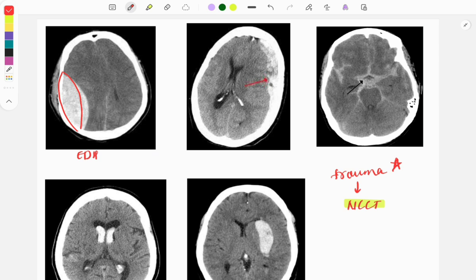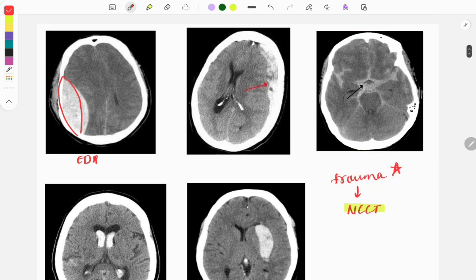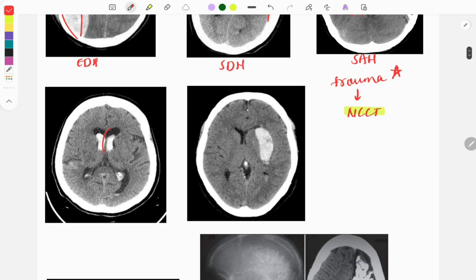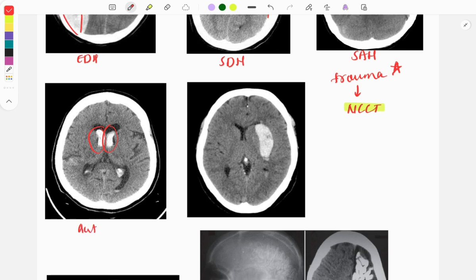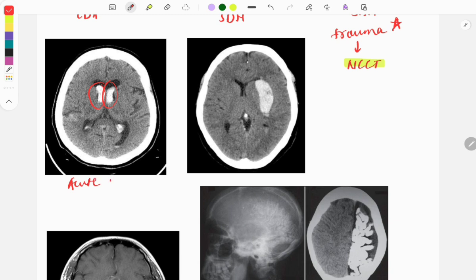There is no way you can skip brain hemorrhages — you need to know every point related to them. The next image shows subdural hemorrhage: the bleeding is crescent-shaped, a classical finding seen in subdural hemorrhage. The next image shows a star-like appearance called the star of death, seen in subarachnoid hemorrhage. Then there is an image showing bleeding in the ventricle — intraventricular hemorrhage.